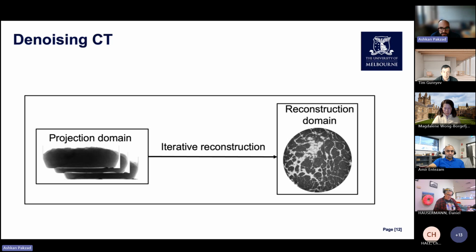So you'd be looking at the acquired signal, and you'd be able to prevent the noise propagation to the reconstruction. However, you need to ensure that you preserve the spatial correlations to prevent artifacts arriving in that reconstructed image. And you could look at iterative reconstruction, so that while performing your reconstruction, you can account for this variation due to noise in your signal.